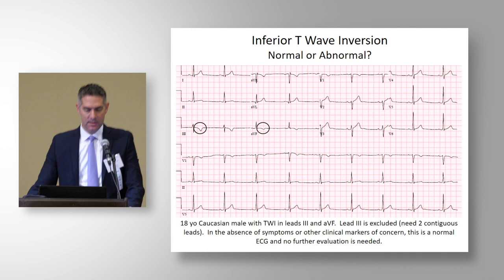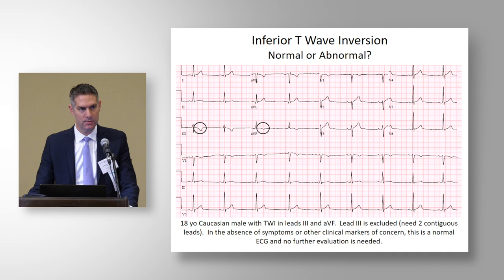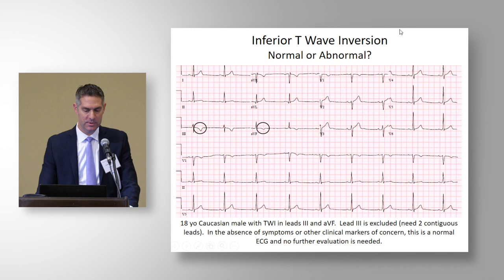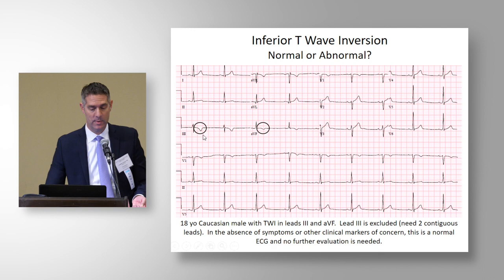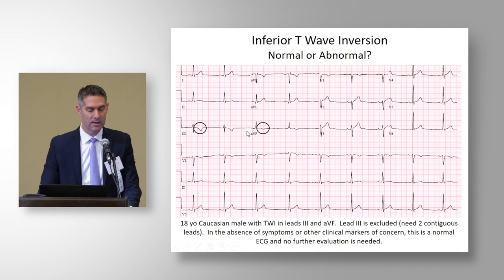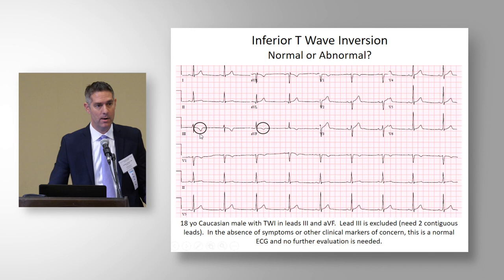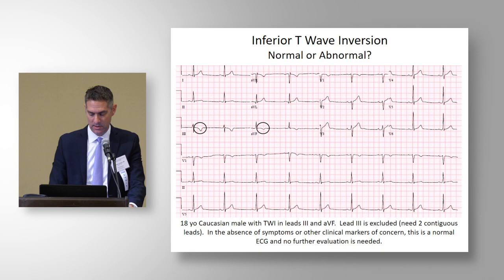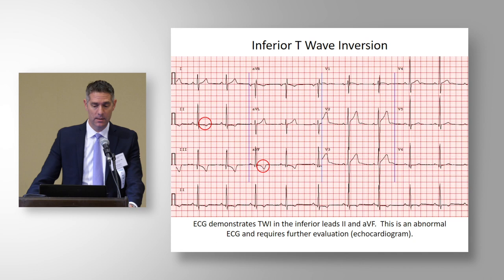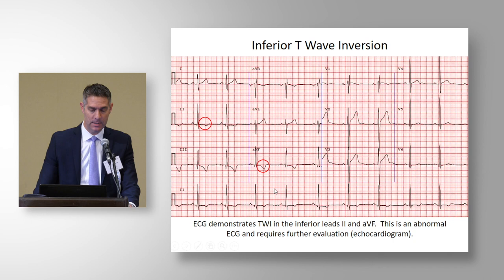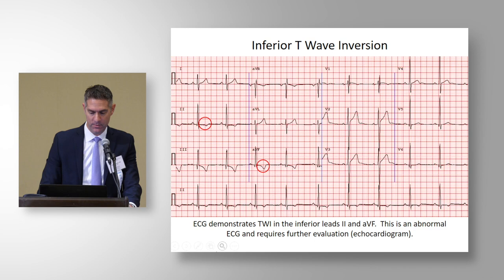Inferior T-wave inversion — when you look at this ECG, is it normal or abnormal? This is one of the challenging ECGs or potential pitfalls. We see T-wave inversion in AVF and lead three. But to truly meet the definition of inferior T-wave inversion as defined in the international recommendations, it has to be in two contiguous leads, and in the inferior leads that means two — excluding lead three. So this ECG in an asymptomatic athlete would not require more evaluation. In contrast, the next example of inferior T-wave inversion with inversion in AVF and lead two — two contiguous leads — would be considered abnormal and require further evaluation beginning with an echocardiogram.